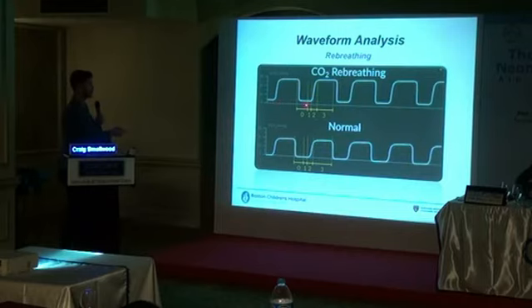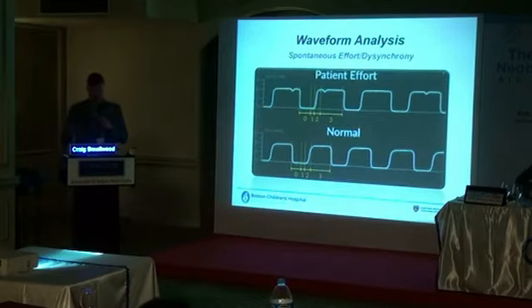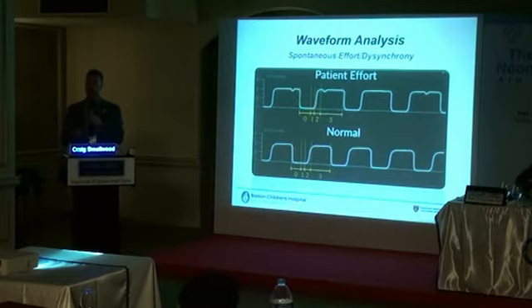We want to start inhalation at 0, and this is a little bit elevated above there. So, patient effort. Dyssynchrony, ventilator asynchrony, whatever you want to call it, is increasingly a problem in the adult literature. They've spearheaded this, and we have always been very sensitive to ventilator asynchrony during neonatal and pediatric ventilation, because the devices we use were usually built mostly for an adult population, and we're trying to apply them to our children.